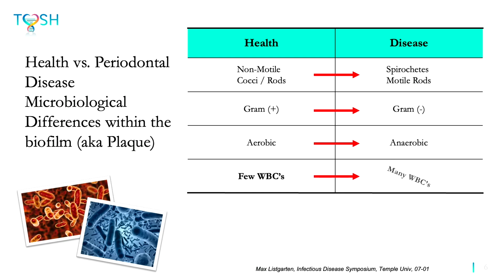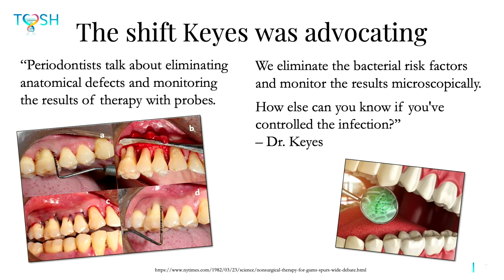In healthy slides, we'll occasionally see a white blood cell, but once we get into a really unhealthy slide, we see a lot of white blood cells, because those neutrophils are our body's primary line of defense. They produce an antimicrobial effect to help the body decrease the infection.